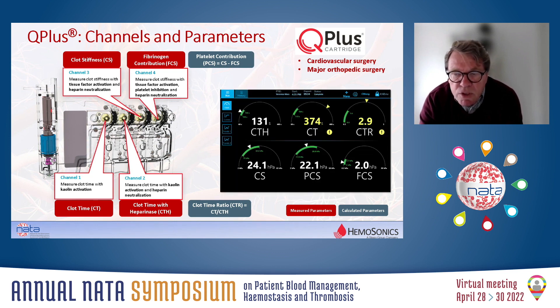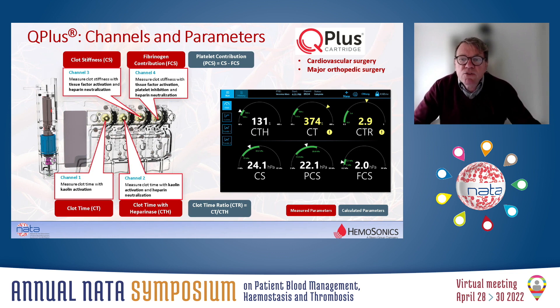This is how the results are displayed on the system by means of simple-to-read dials. On the top line you see the clotting parameters: CTH in the presence of heparinase, CT without heparinase, and the ratio. In this example, CT is prolonged but CTH is normal, which is an indication of the presence of heparin. On the bottom line you see the clot stiffness parameters: total clot stiffness, the fibrinogen contribution to clot stiffness, and the platelet contribution to clot stiffness, which is calculated. A numerical value is displayed, and an arrow points to the place on the measurement range, with a green bar indicating the normal reference range.